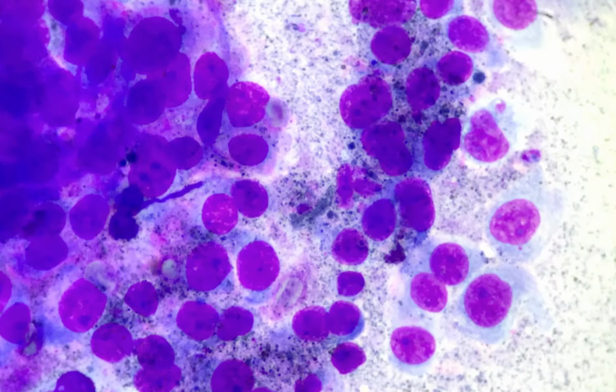I'll show you how. If you see this slide here, the cells are cohesive and the cells have variable nuclear cytoplasmic ratio. You can see this cell here has intermediate nuclear cytoplasmic ratio, but cells here pretty much look like they have high nuclear cytoplasmic ratio, and overall all cells have marked anisocytosis. All the cells show marked anisocytosis and marked anisokaryosis, and the nuclear chromatin is not uniform at all.